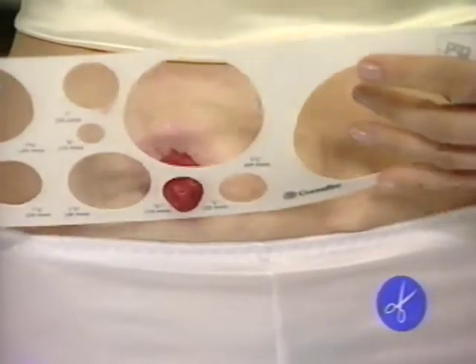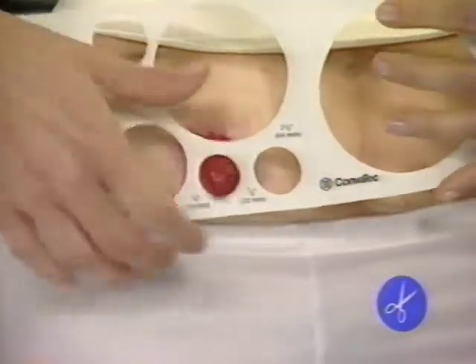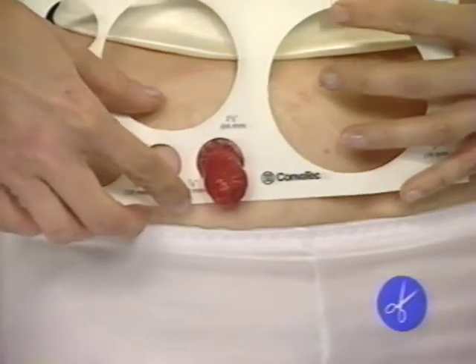Take the stoma measuring guide and place it over your stoma. Measure the widest part of the stoma like this. If you have recently had your surgery, it is important to take stoma measurements each time you apply a new pouch. Remember, your stoma will continue to shrink in size for at least 6 to 8 weeks after surgery.